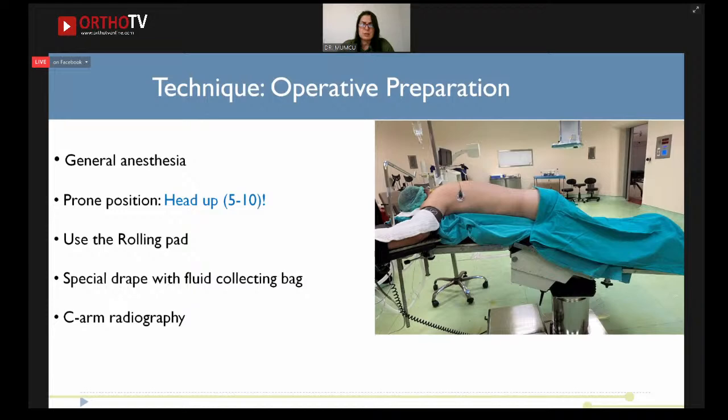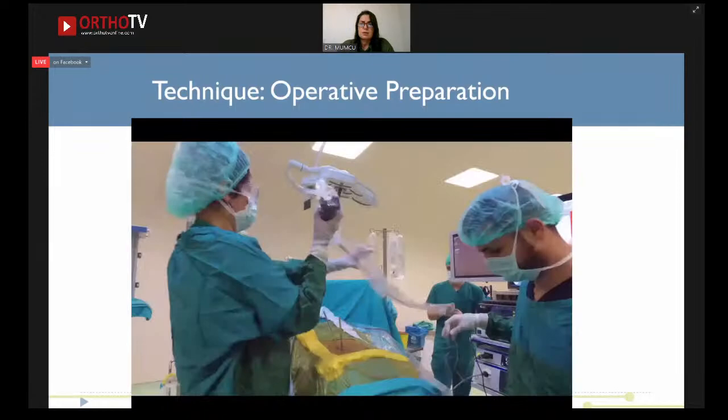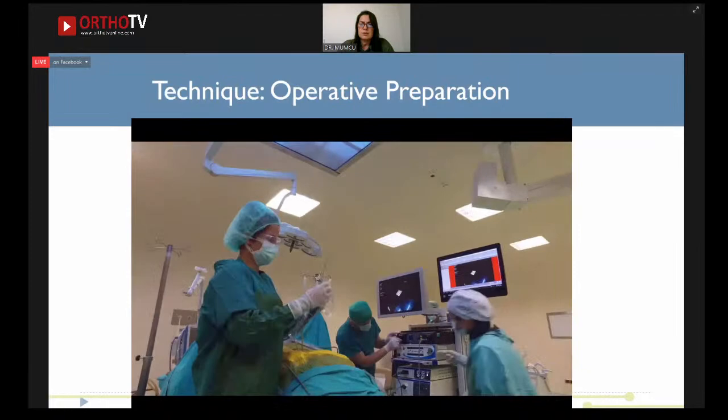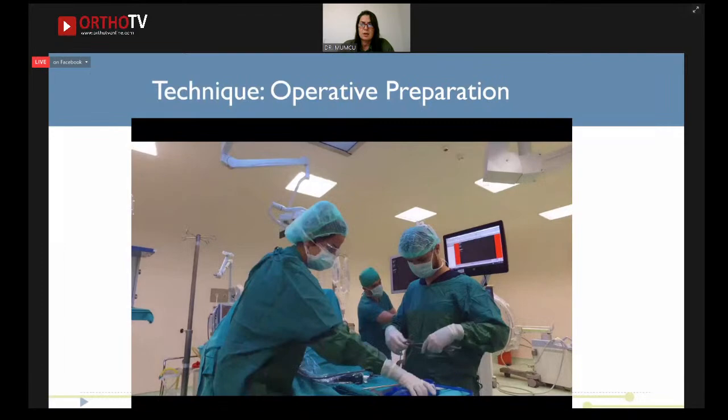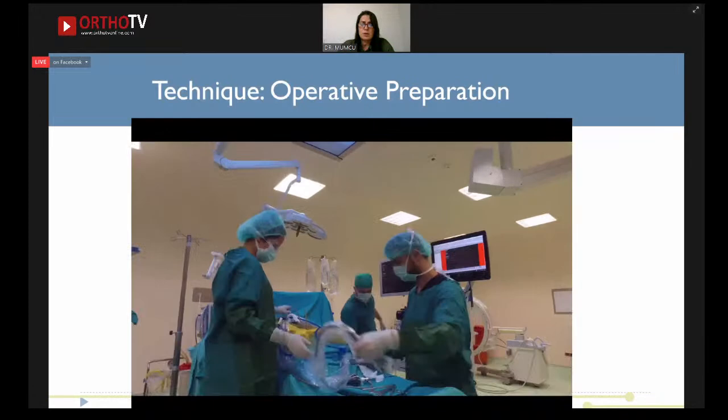The next issue is about your team. Your team is very important as well. There are lots of details to prepare before starting the UBE. That means your nurses need to know how to set up the water pump of the irrigation system, how to connect your video system, and so on. It is not only the surgeon who must be trained with the manual skills, but also your team, your nurses, your technical staff for the final success.